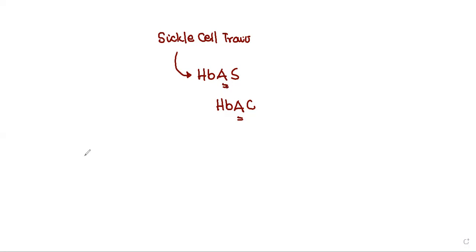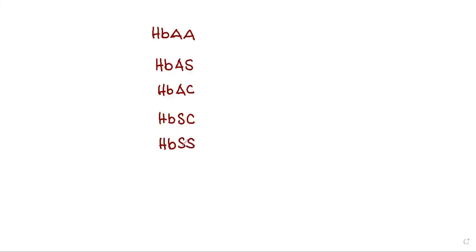Yes, Doc. So it means that as individuals, once you have HbAA, you are said to have a normal hemoglobin, and so you don't have a hemoglobinopathy. Another individual can be HbAS, that's a trait. HbAC, that is a trait. HbSC, that's a sickle cell disease. HbSS, that's a sickle cell disease, also called sickle cell anemia. HbS beta thal, and all that. Do you see that?